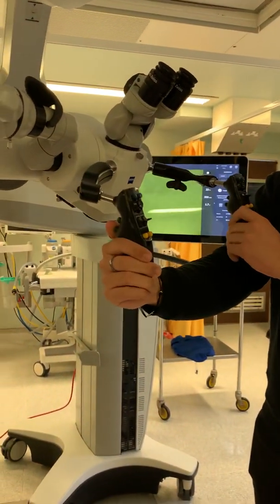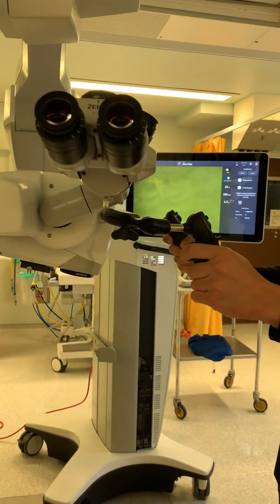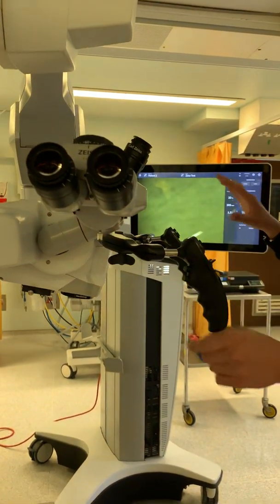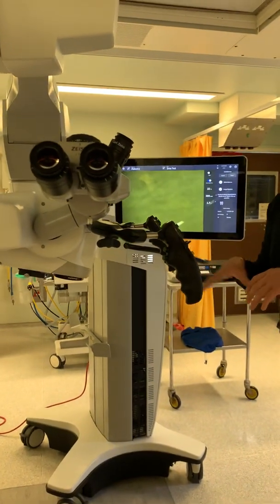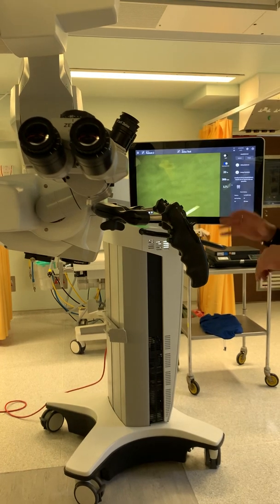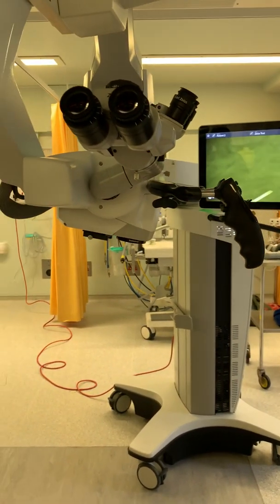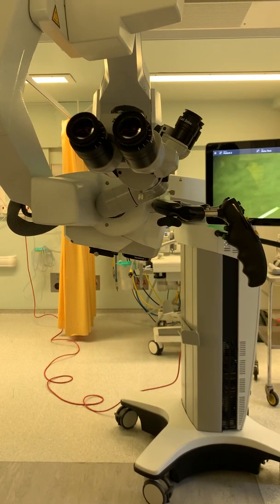Yes, it does save the settings. Whatever you change it to, that's what it will stay at — it won't revert. That's why if we are going to change things, we'll create new profiles. As standard, the current setup suits everyone.